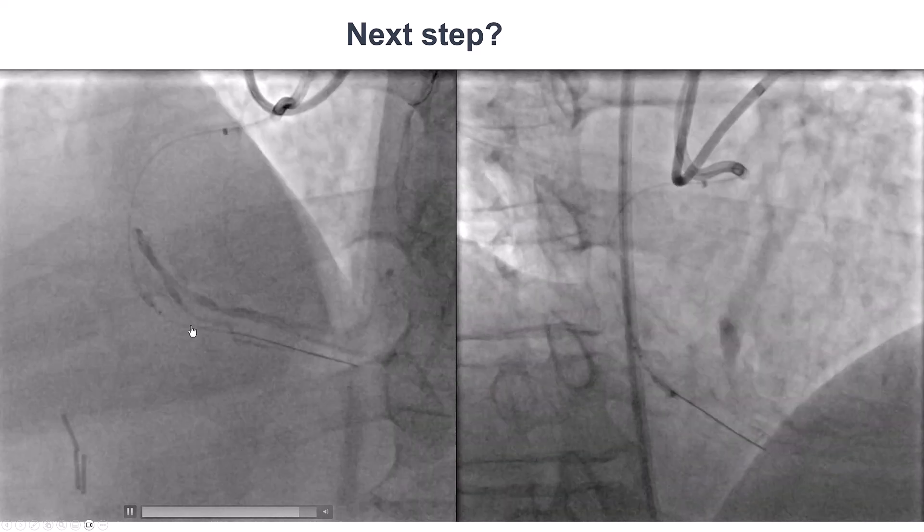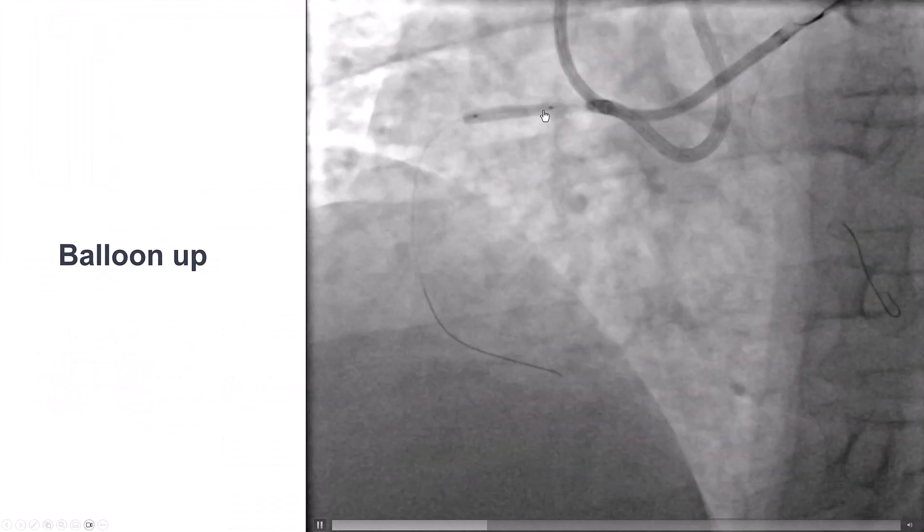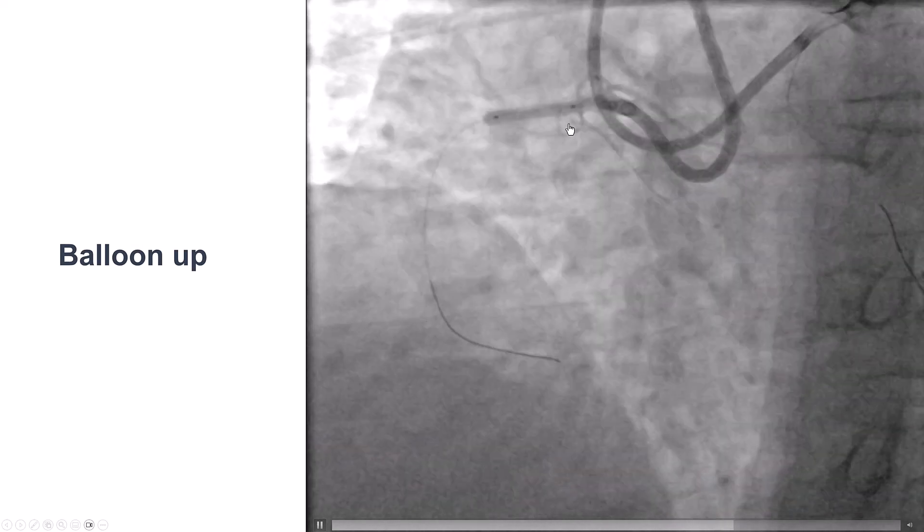This looked fairly concerning for a perforation. The first step for every perforation is to use a balloon to seal it. That is exactly what we did — ballooning the proximal right coronary artery.